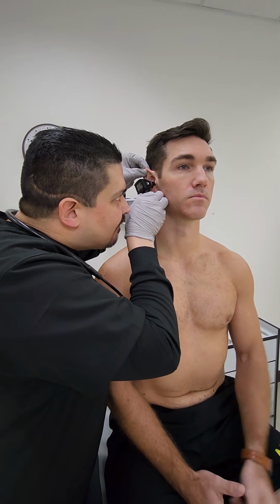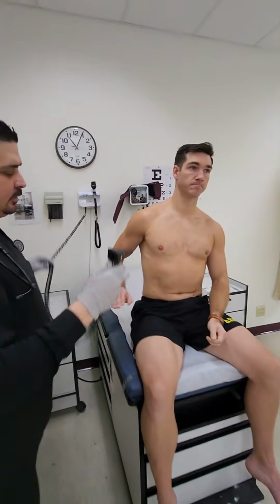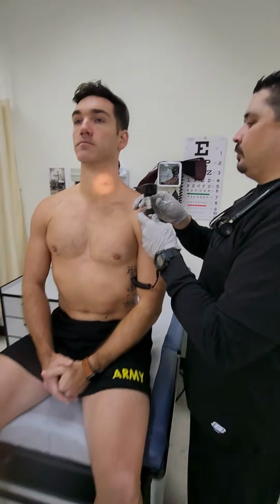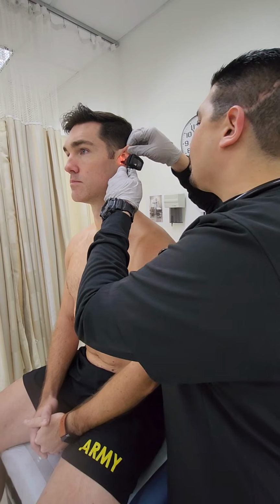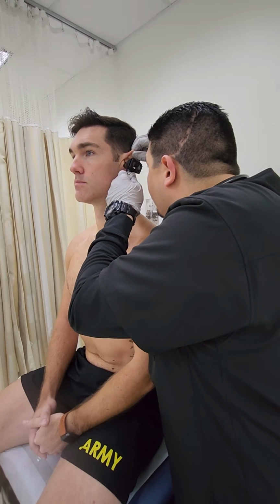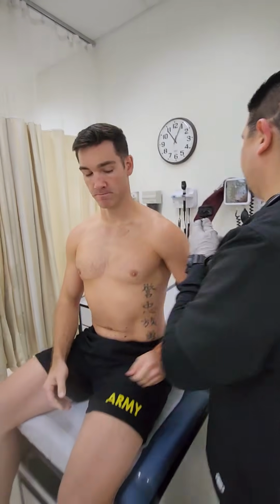Hold your nose and Valsalva for me. Okay, good. Switch to the other side. Perform otoscopic examination bilaterally. Valsalva for me. Okay, good.